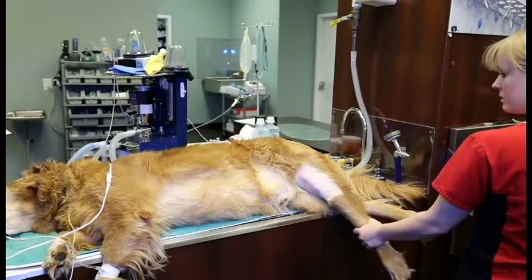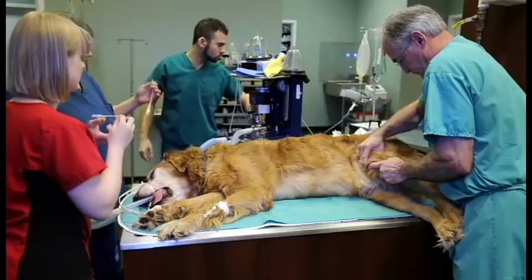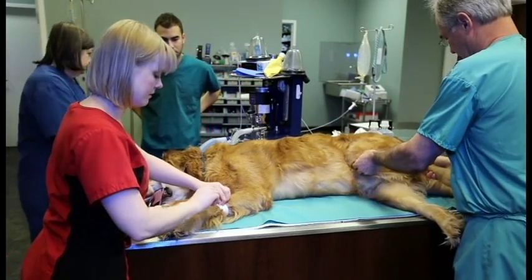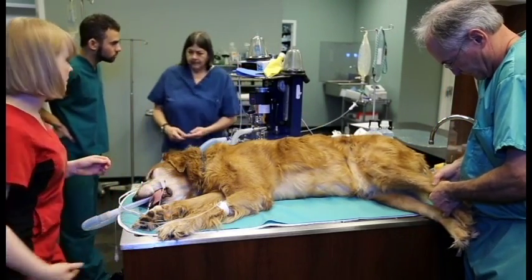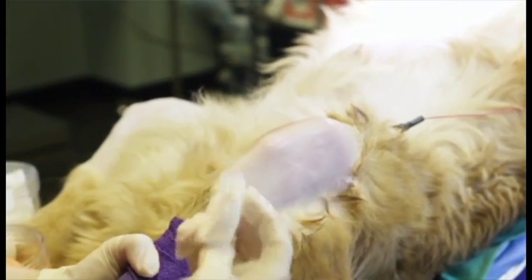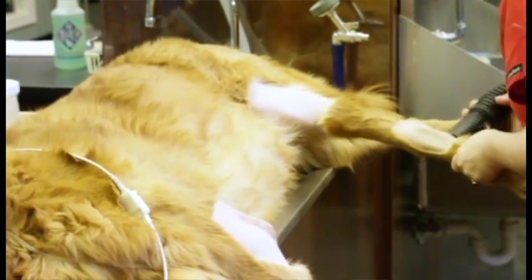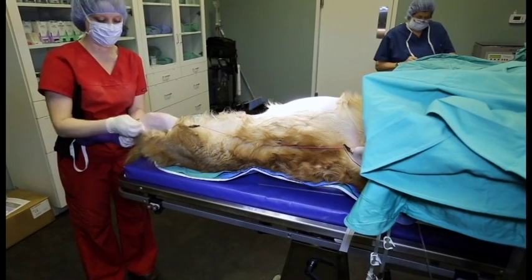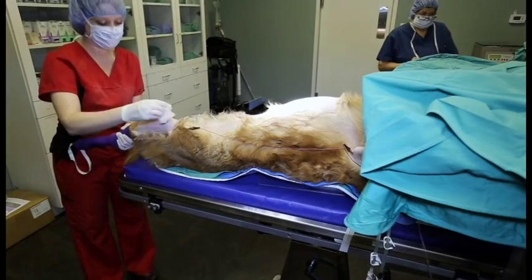Patients are best placed in lateral recumbency with the selected joint positioned uppermost and easily accessible. Sedation is typically recommended; however, with experience in selected patients and certain joints, chemical restraint may be optional. The chosen joint is clipped, vacuuming the hair away, and the area is aseptically prepared. If multiple joints are selected, perform all clipping and vacuuming concurrently. Initial preps can be performed on all joints followed by aseptically preparing each joint independently prior to joint penetration.